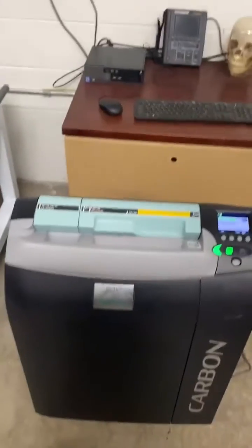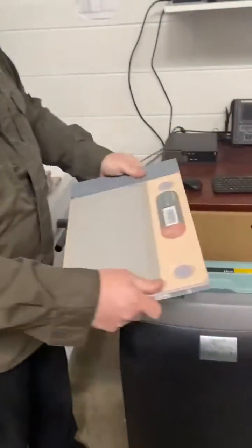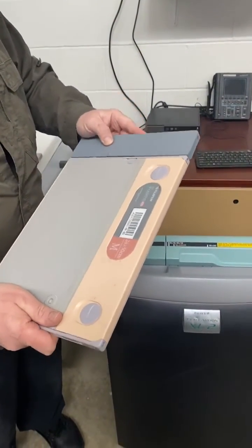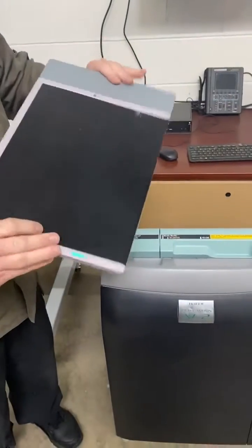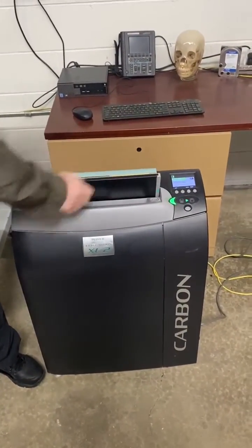So what we've done is we've retrofitted the Clearview cassettes so they will work perfectly. The 50-micron plate gives you the exact same image quality, and we have the same adapter that goes on there and works with the XL2.